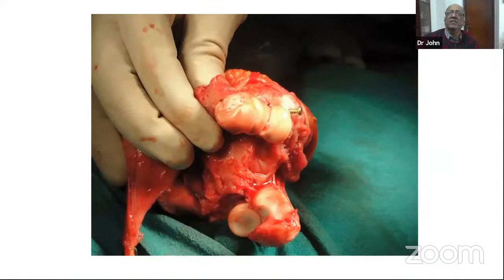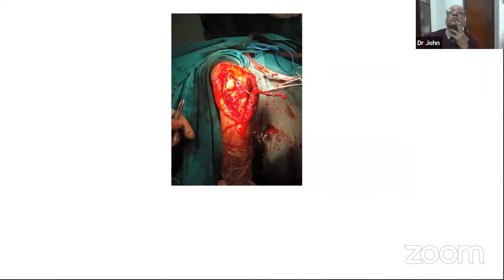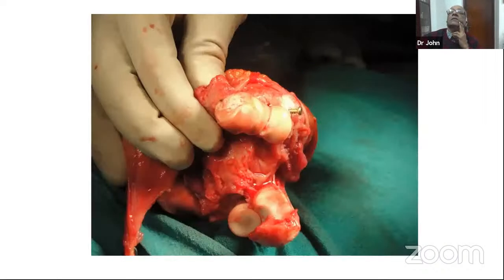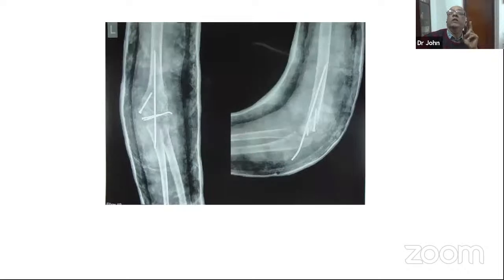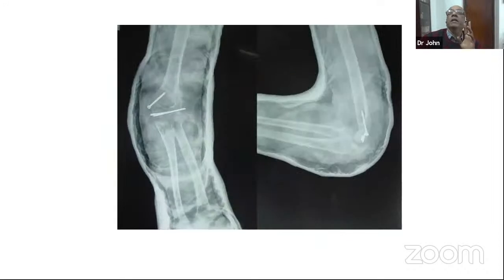We use these 2.7 screws, a threaded wire and a K-wire. And then we had to put the joint back. One of the advantages of this approach was we could repair the triceps fascia slightly more proximally so that we could get flexion of the elbow, okay? We did put a transarticular wire because I wanted to be sure that this is not going to dislocate again. We removed the wire at 3 weeks and put her in a cast for another 2 weeks. Okay, so those were the x-rays at that stage.